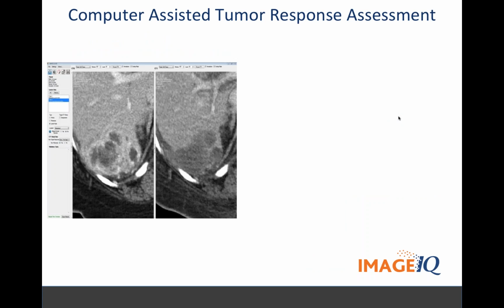So you're writing these down and putting them into another system, another EDC, another electronic CRF, and that causes transcription errors and variability that could lead to adjudication. You got it. You kind of led into it nicely. As radiologists, and even as oncologists, we're used to looking at PACS workstations, and those are designed to handle any type of image in any situation.